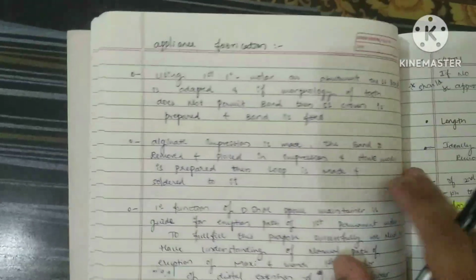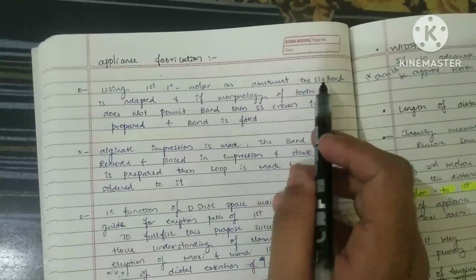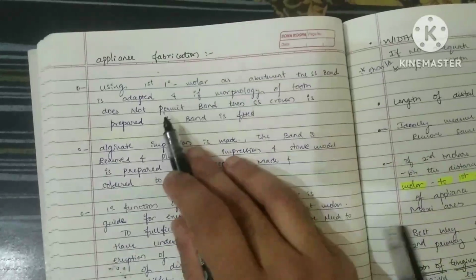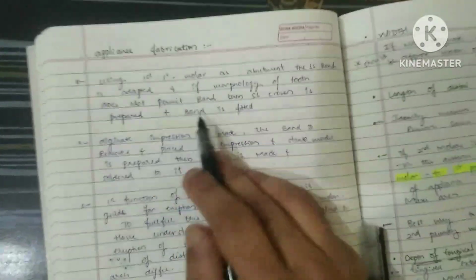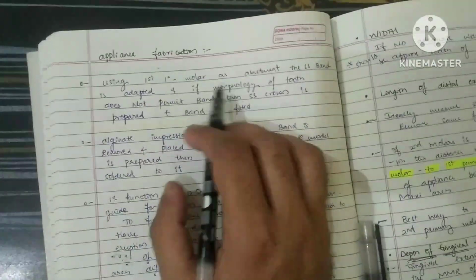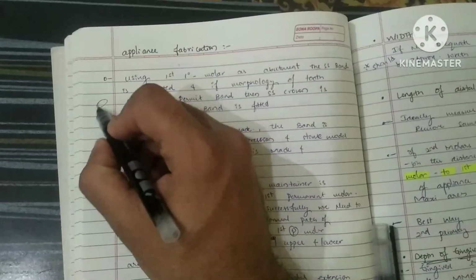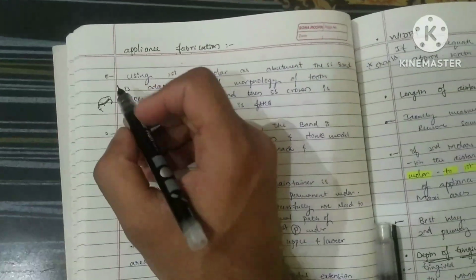Now coming to the appliance fabrication, how do we construct this? Using the first primary molar as abutment, the stainless steel band is adapted, and if the morphology of the tooth does not permit the band, then a stainless steel crown is prepared and the band is fitted. So we are going to use the first primary molar and prepare the abutment. Suppose this is the first molar we have, and we are going to take it as an abutment.